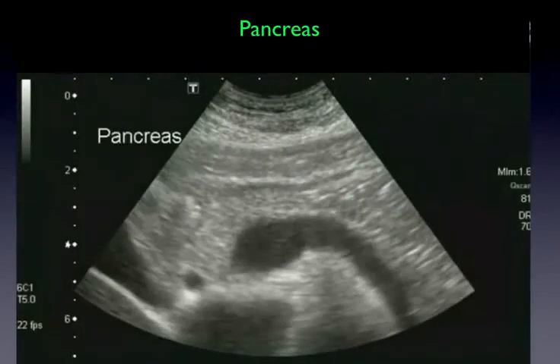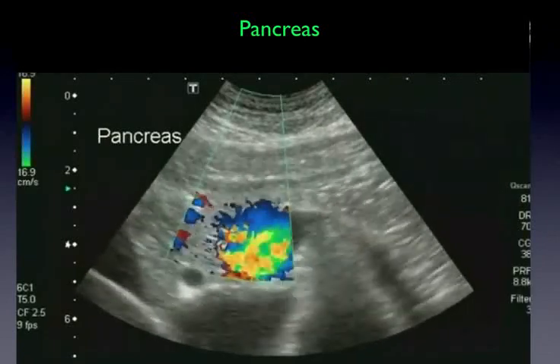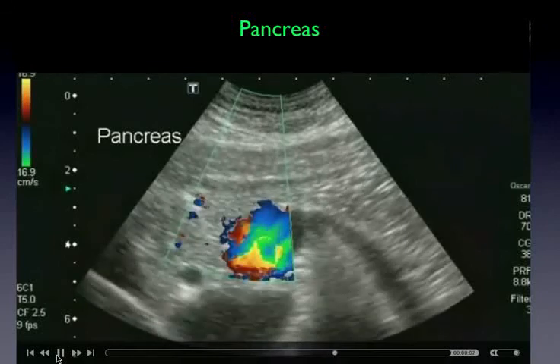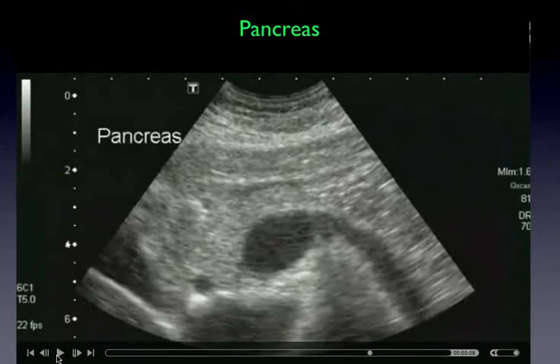Now let's look over here. There's your lake, and that's the splenic vein. There's flow on this that was placed by somebody to say, is that the vascular structure? And the answer is yes, it is. And now we can see that here's the splenic vein, and there was a question by the resident who did this about this structure over here.